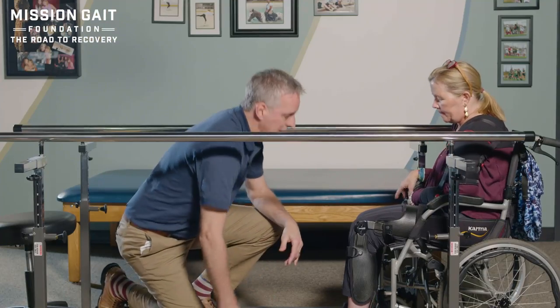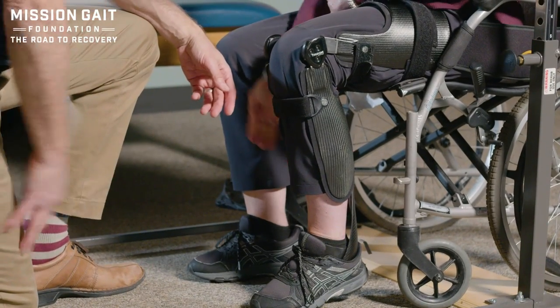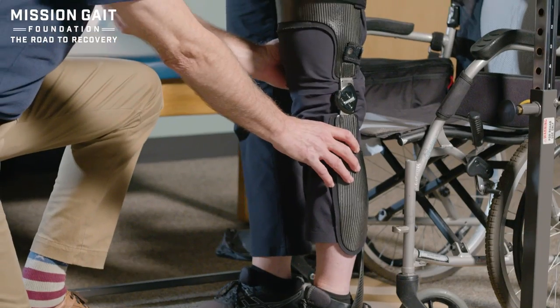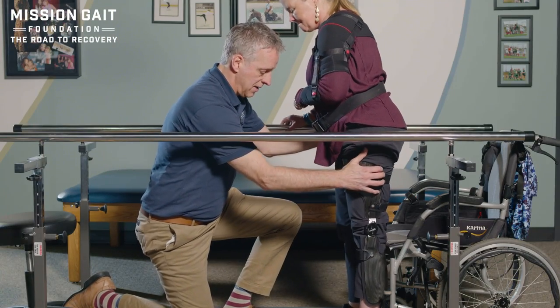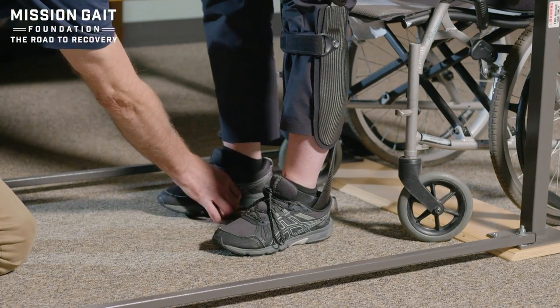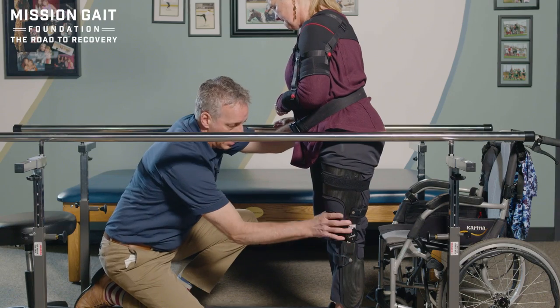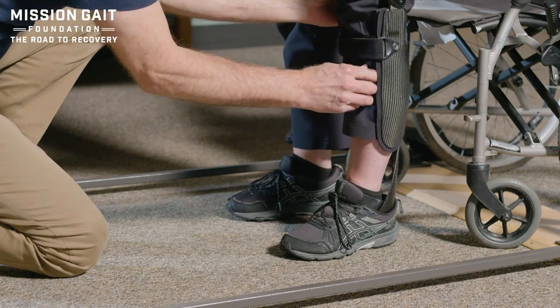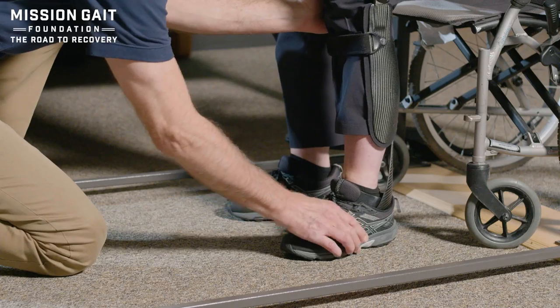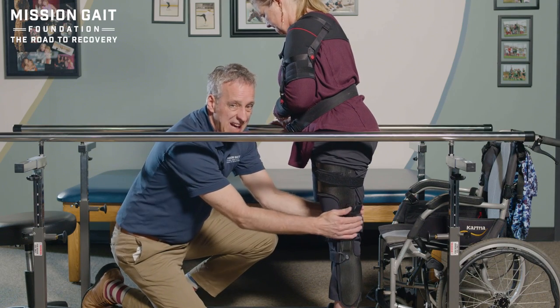The second time, Eleanor, I'm going to have you slide forward and stand up again. She moves forward in the chair, gets that leg underneath her where she feels confident, and from the very beginning I want her to push down into that brace and take some load on it. Come all the way up to standing — give me a half step forward. Now all I want from her is to stand nice and tall, shift the weight onto that orthotic side. This is getting her confidence that this leg can hold her up, and at the same time it gives me a chance to see if anything is rubbing or is a problem, whether the straps are tight enough but not too tight. Remember, the strap in back is stopping hyperextension — that's going to be one of her biggest concerns.